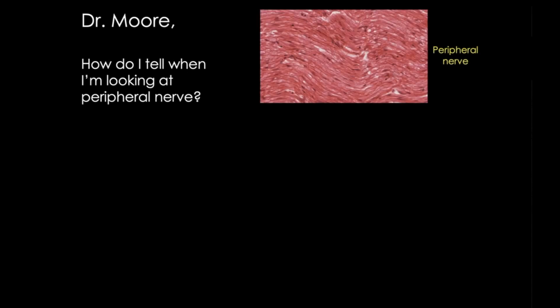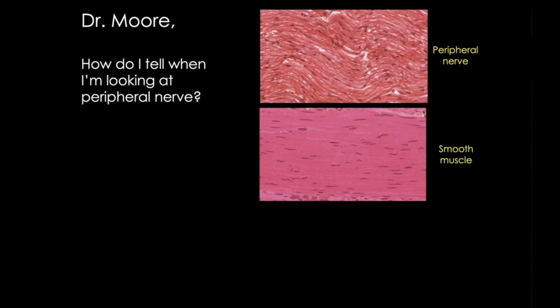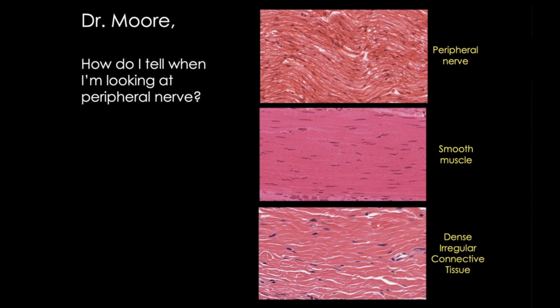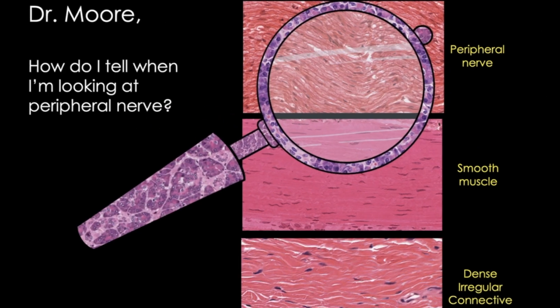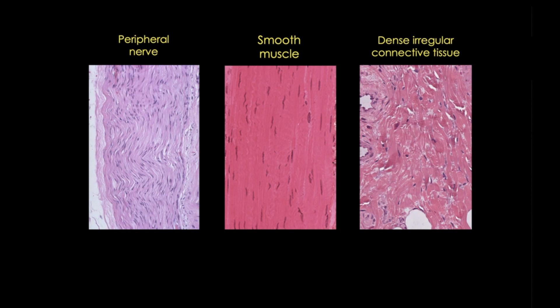Students often mix up peripheral nerve with smooth muscle and dense irregular connective tissue. Let's investigate. In routine H&E slides, peripheral nerves do resemble these other fibrous tissues, particularly in longitudinal sections. All three tissues are eosinophilic and they all contain scattered elongated nuclei. So without other clues such as location in the body or recognizable features such as endothelial cells in a blood vessel, identification isn't always easy. But there are several things that may help you tell these tissues apart.